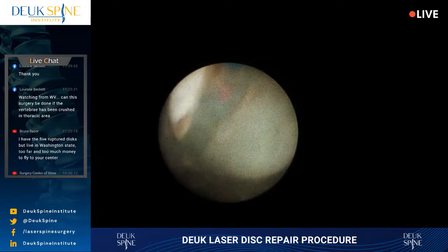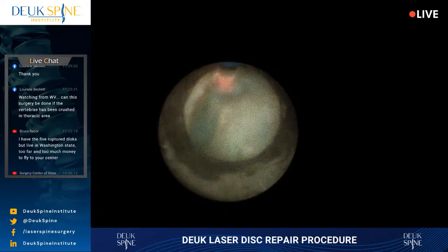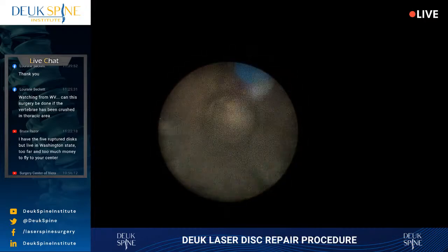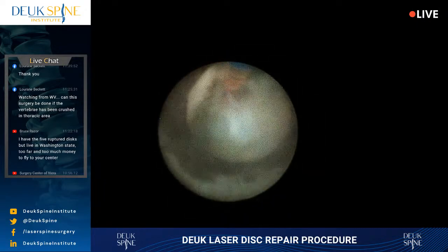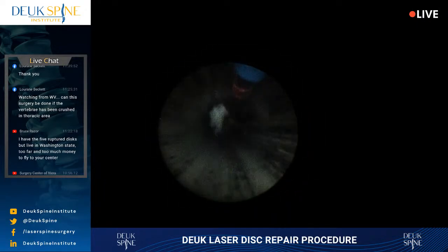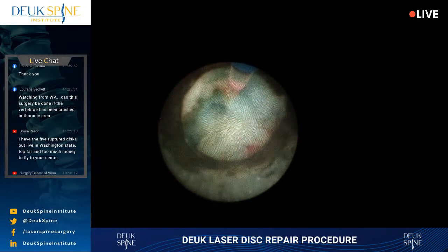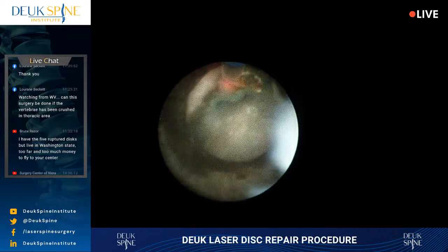Did somebody come up with the answer of what the laser does besides vaporize? No, we haven't. Oh my gosh. Cavitation. That's correct. It creates a pressure wave. And that pressure wave in the liquid blasts like a pressure washer. It blasts everything out of little holes. Cavitation is a powerful sound wave moving through liquid. It causes the liquid to deform or cavitate.